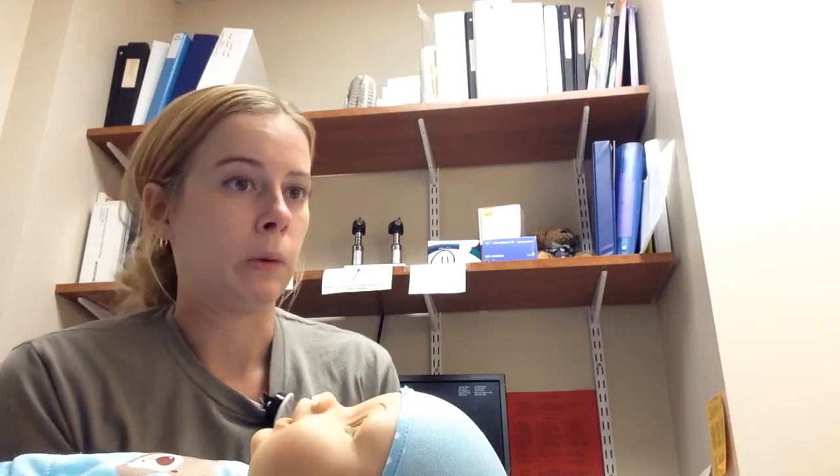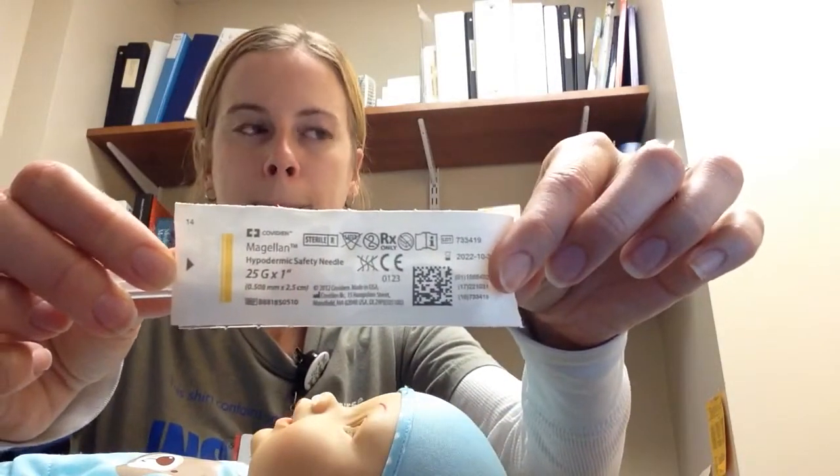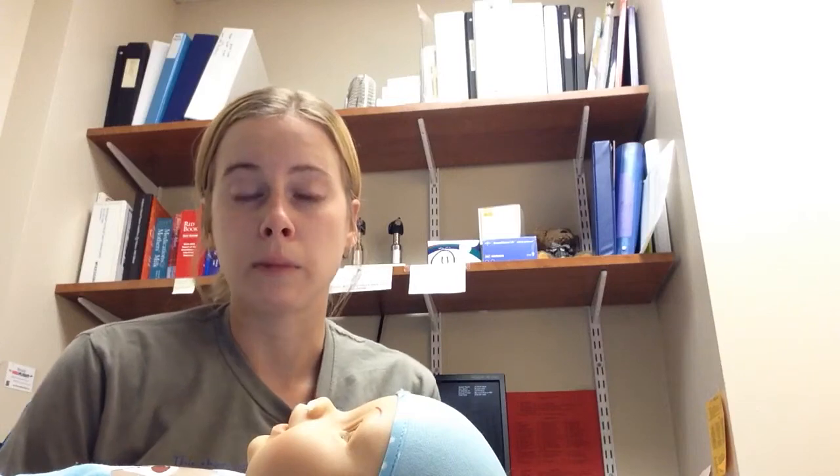Trying to find the appropriate syringe then, our needle size. Most of our little kids up here would use a 22 to 25 gauge needle, anywhere from 5/8 to 1 inch. And these are one of the examples here that we have. And then the max amount that you want to put into a muscle is also based on the size of the muscle. So a lot of the infants will not get more than 1 ml of medication into one muscle. If you get medication from ER and it's got 1.5 ml of medication in it, you're going to have to split it and give 2 shots.